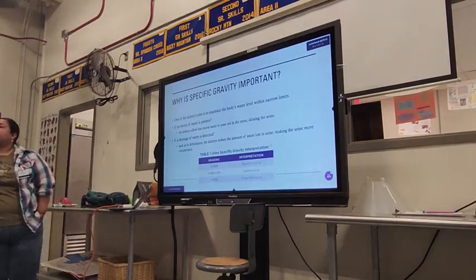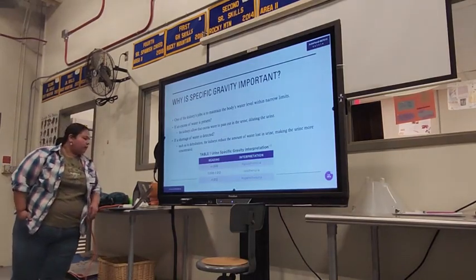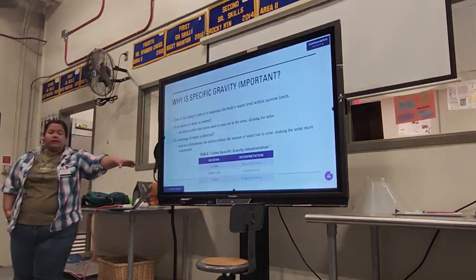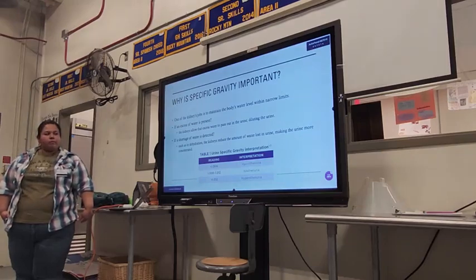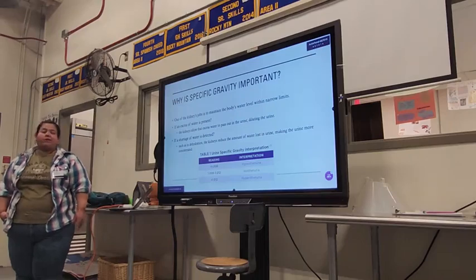Okay, so we have our interpretations, right? We have our reading. If it's less than 1.008, something's wrong. It's hyposthenuria.